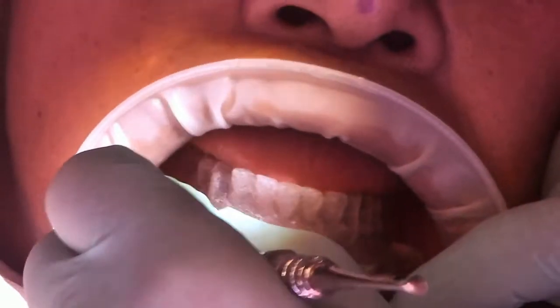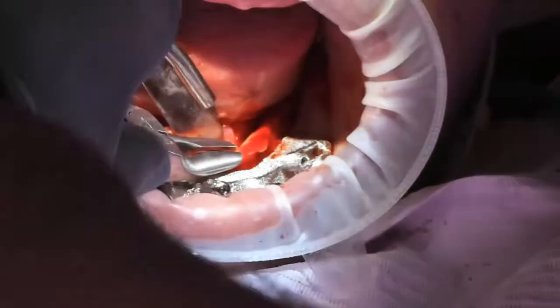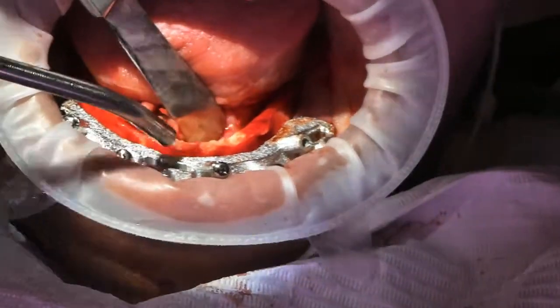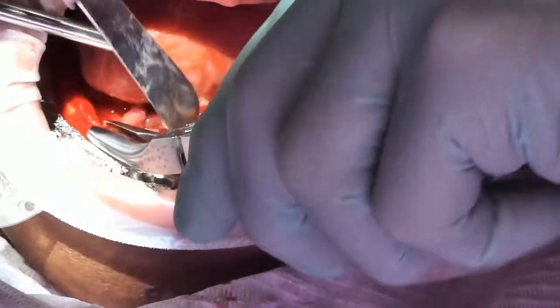So at this point, Dr. Towle is just going to lay the flap and then reinsert the pin guide in order to seat the fixation base. Now, the fixation base may also be able to be seated by just simply laying the labial flap and then finding the holes to pin into place.